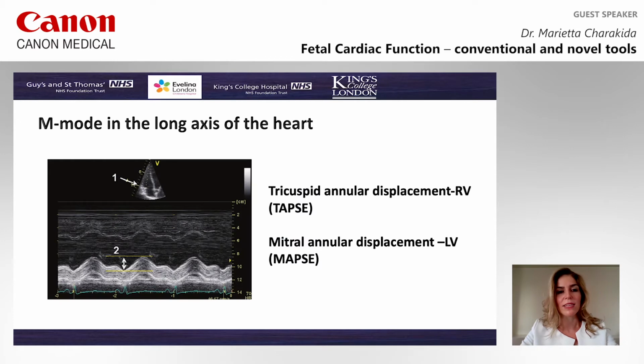M-mode can also be applied in the long axis of the heart to calculate the tricuspid annular plane systolic excursion, commonly referred to as TAPSE, and from the left side the mitral annular plane systolic excursion, known as MAPSE.